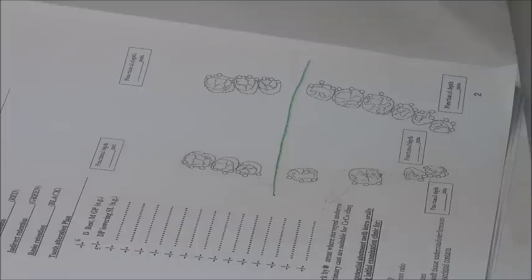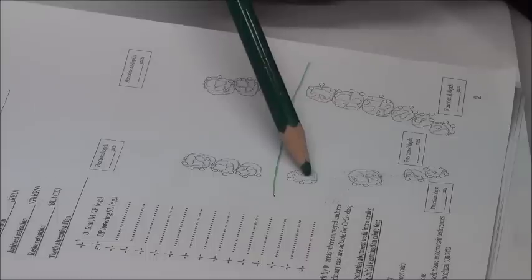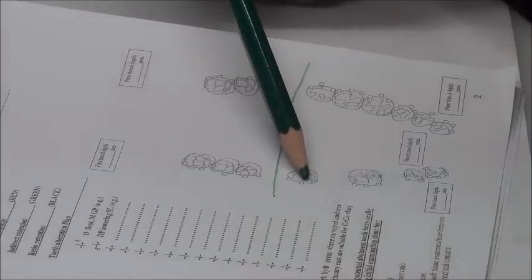You'll see it in a moment. Okay. Come on, we're done. Make the partial from here to here. What is another rule of partial dentures? Cross arch stabilization.